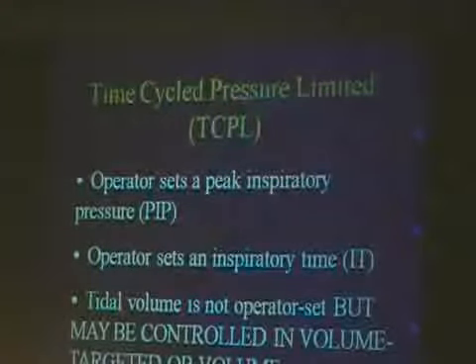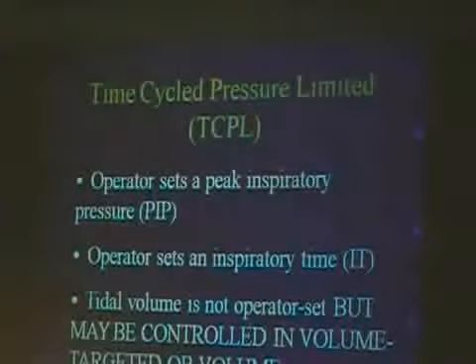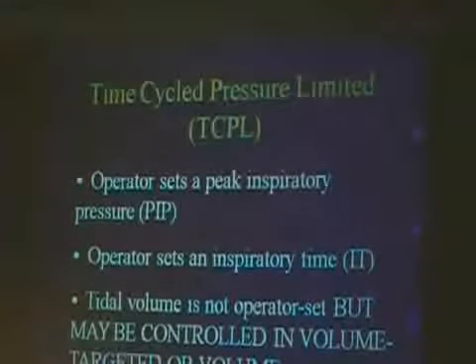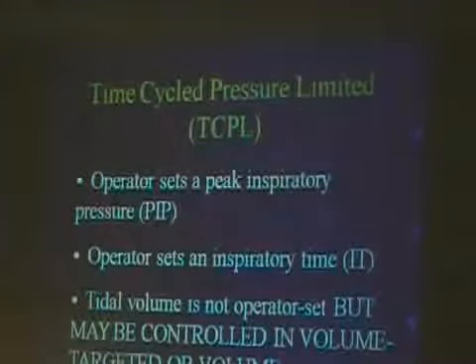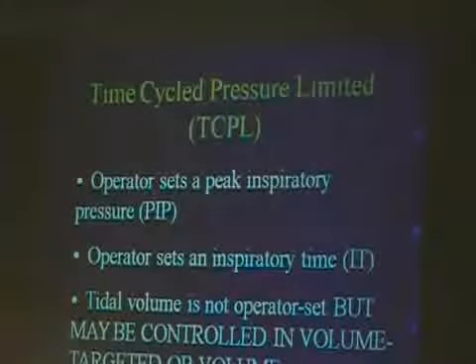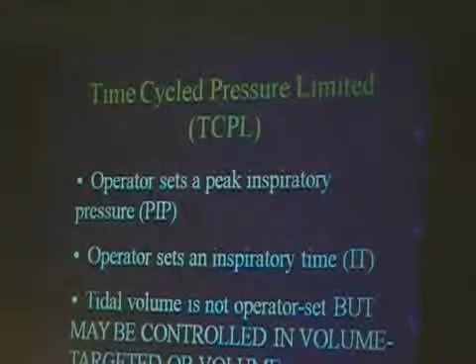So the thing that I want you to understand is that with time cycle pressure limited, which is what we do, in other words, we set a pressure, right, and we set an inspiratory time, the tidal volume is not set by us. However, it can be controlled by the ventilator when volume targeted or volume guaranteed modes are used. So volume targeted and volume guaranteed modes are pressure modes. They're not volume modes, and that's the big misunderstanding that a lot of people have.